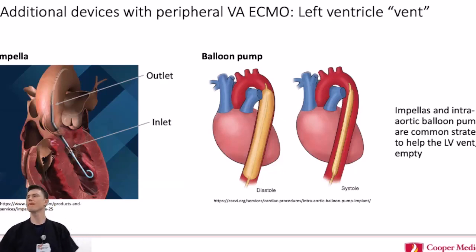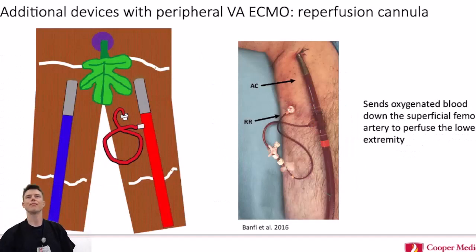Would you expect a Doppler pulse though, when you have the perfusion cannula in? Good question. We actually had a patient who did have a Doppler pulse, but instead of being biphasic, it was monophasic. So you would only hear one beat instead, and it would just be like whoosh, whoosh. Did they have the cannula in or no? Yeah, that's a good point. At least that's what I've experienced.